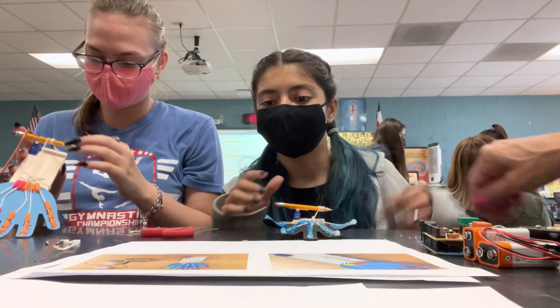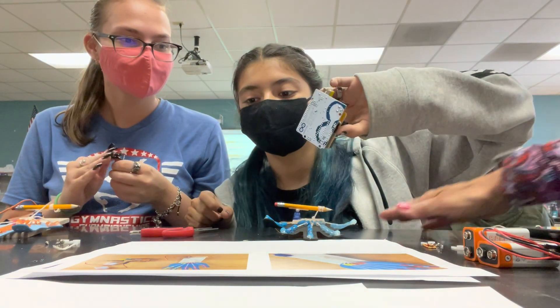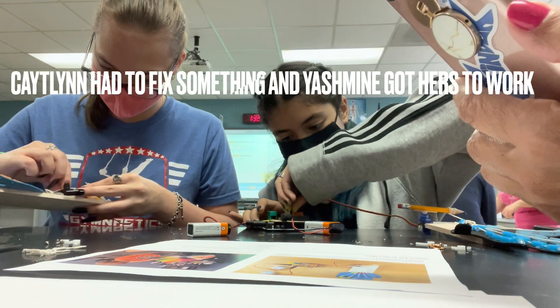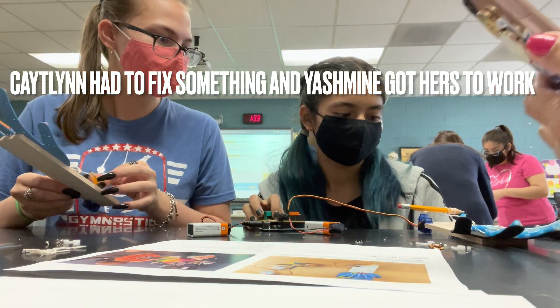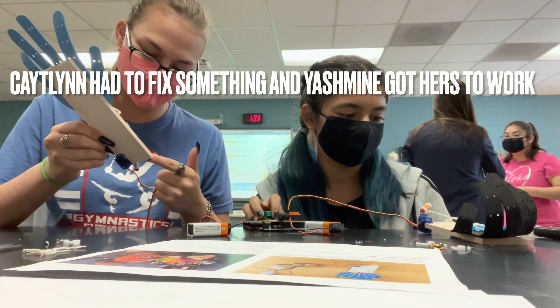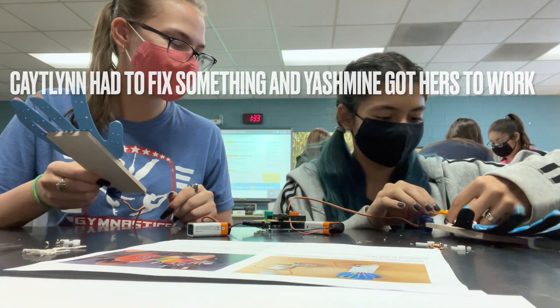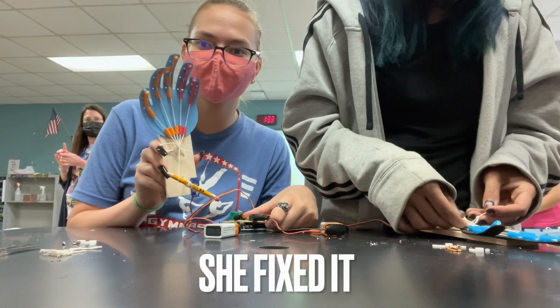We're supposed to plug our hands into our muscle spiker shield and plug that into the two batteries. Okay, I think I glued this one on. Do it one more time.